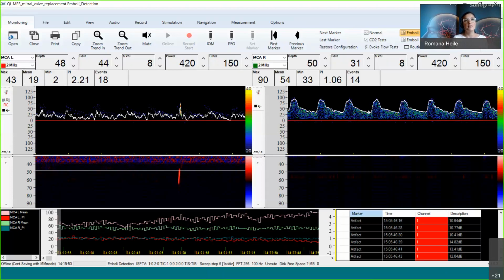Here on the other side, you can see that the compromise is well done. That means if an embolus appears here, we can see it much better than in the previous record that I have shown you. But also here we can see that because of the correct setting of the envelope, we can also believe that the velocity measurements are correctly done.